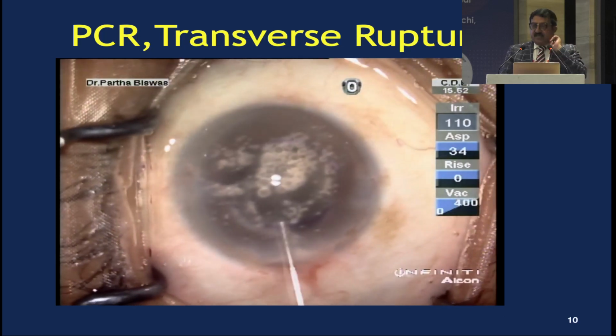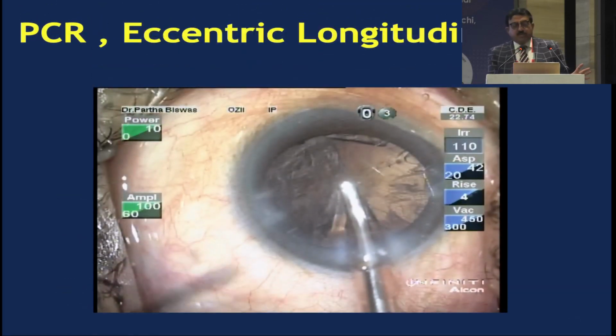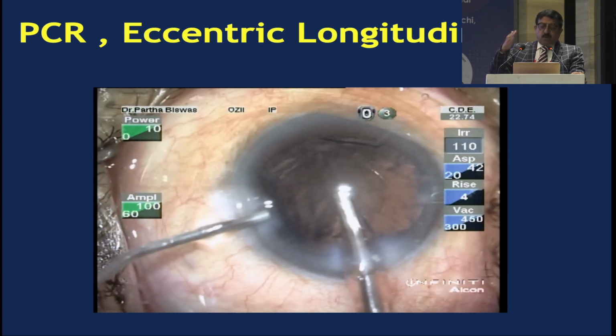This one is nearly a 3-year video, and even today we follow the patient up. Patient is very stable. So the last of my videos is again a similar one, in which this is a more difficult rip. It is an eccentric longitudinal rip.